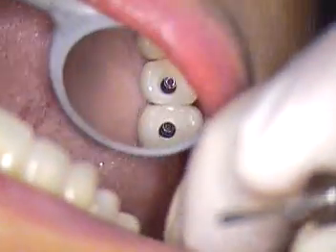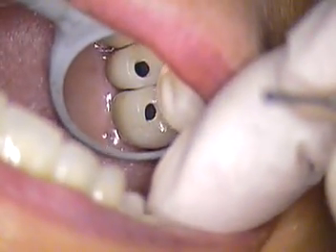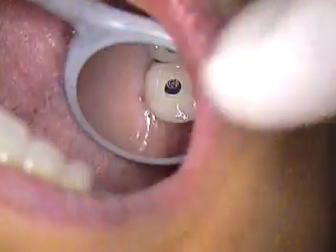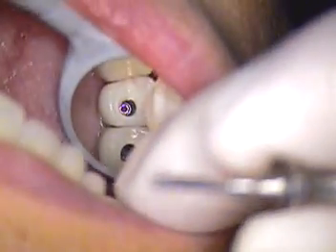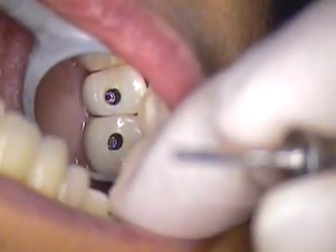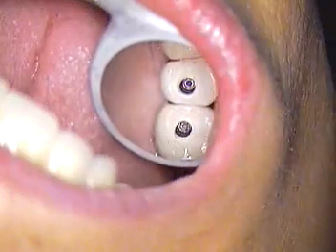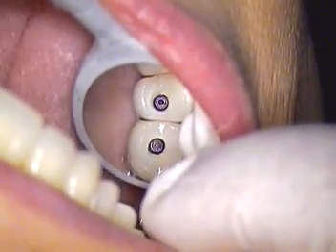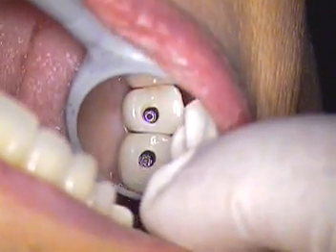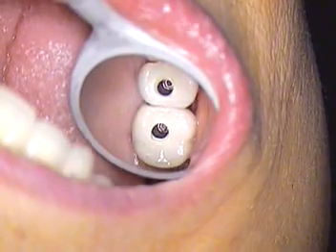Maybe wait a little bit, let the tissue displace, and as that tissue displaces, it'll get easier and easier to tighten the screw thread down versus trying to tighten it all at once. Then you could literally be putting so much pressure on the threads that you could end up with a real problem where the threads will strip or the implant body will break over time. So you've got to do that very carefully. It's very important.